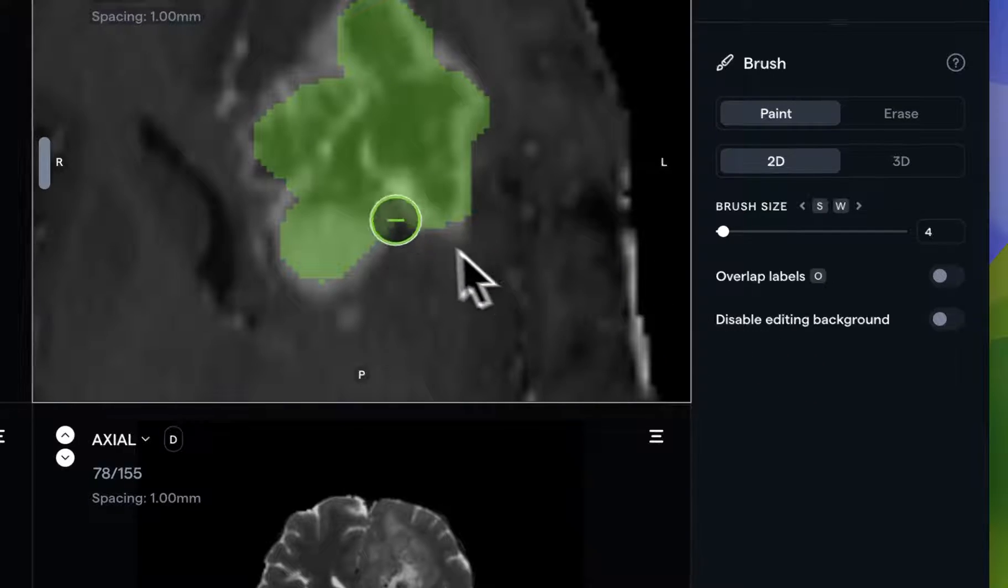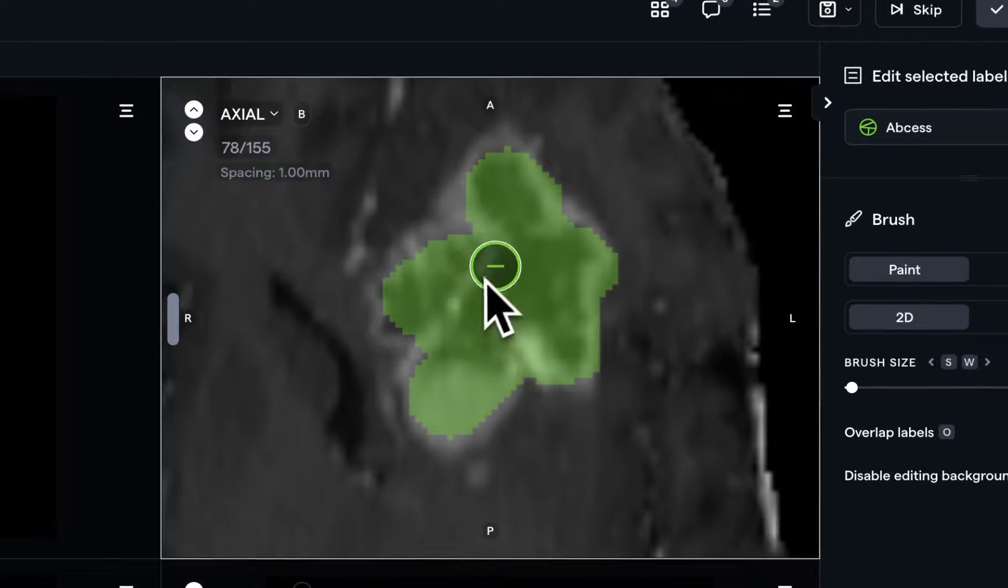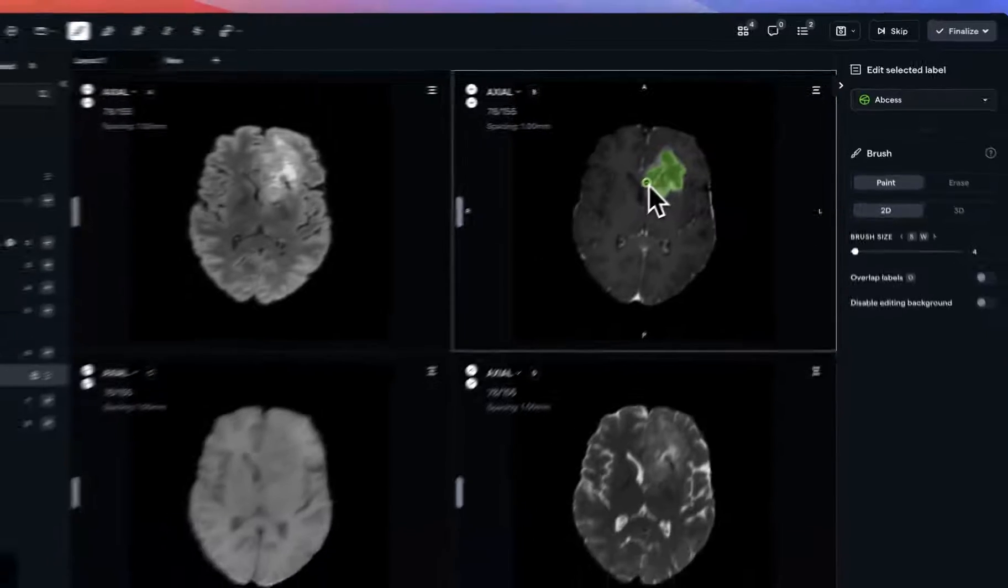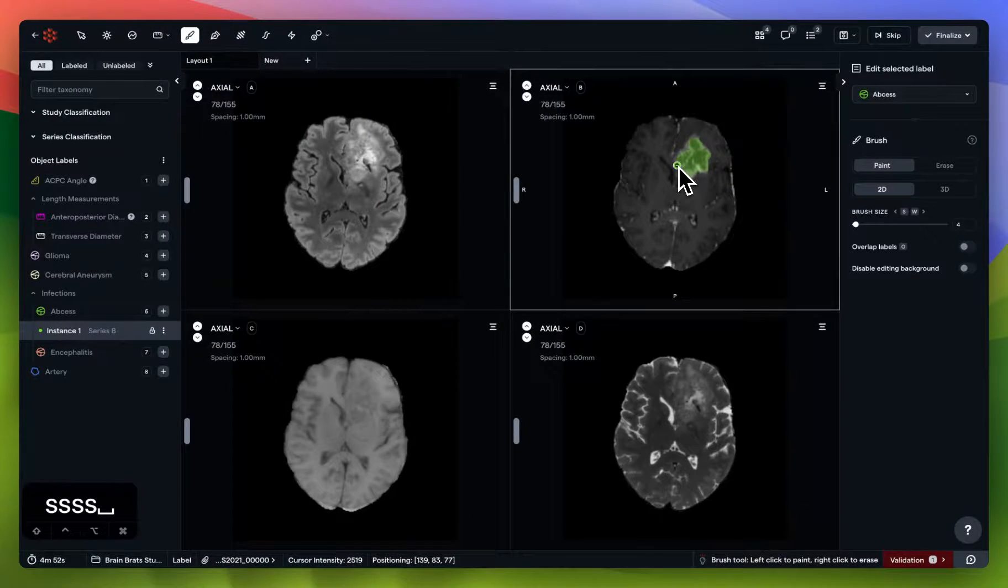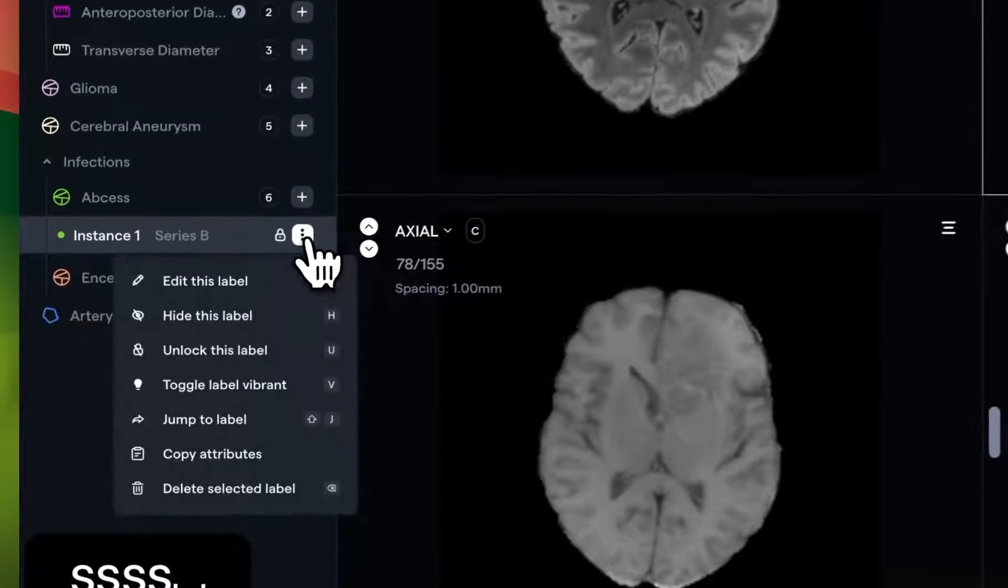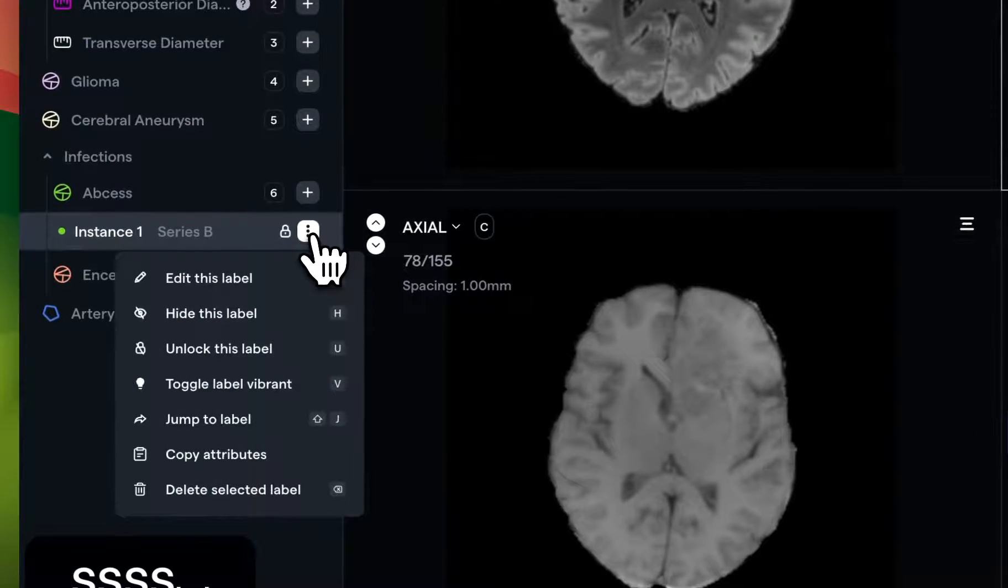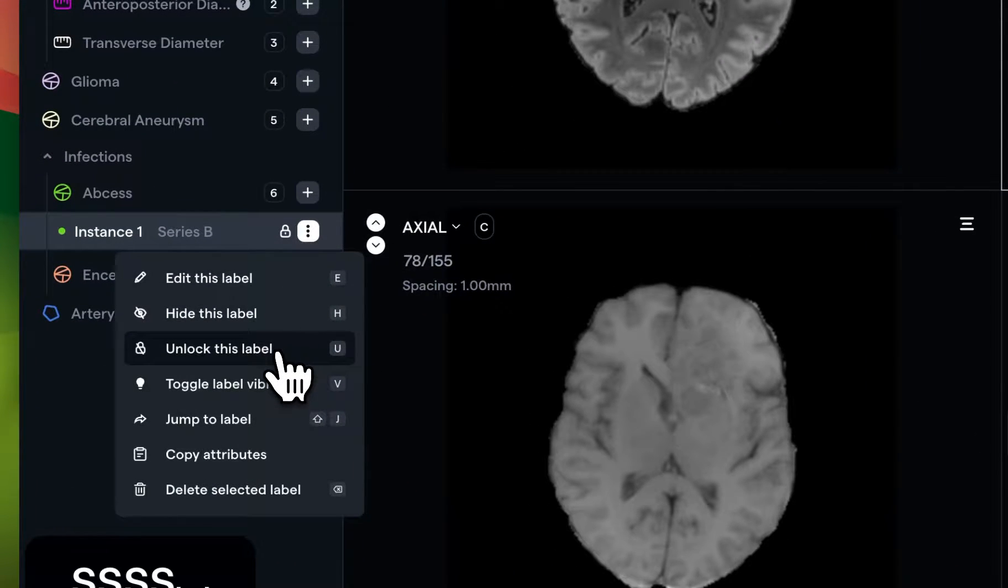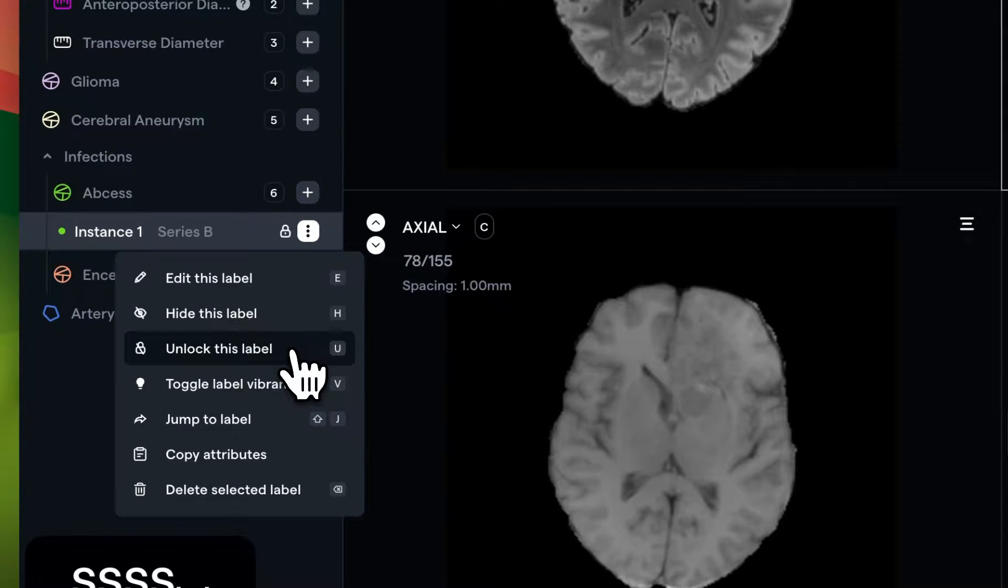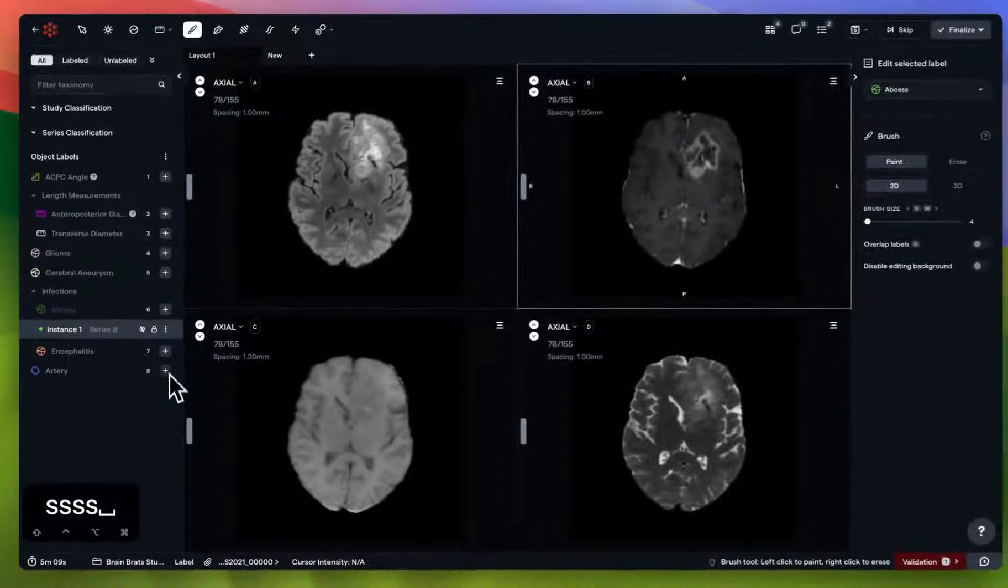Finally, within a viewport, if you want to return to your original view, simply use the space hotkey. For any individual label that you generate, there's also a variety of actions that you can do to it. For example, you can lock a label if you don't want to have any further work done, and you don't want to make sure that no modifications can be applied to it. You can also show or hide a label.